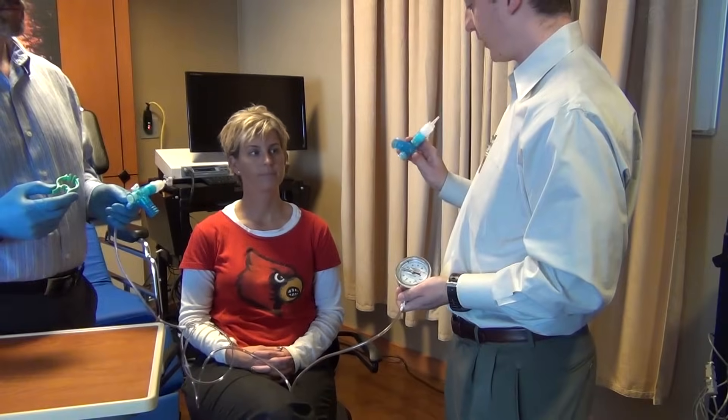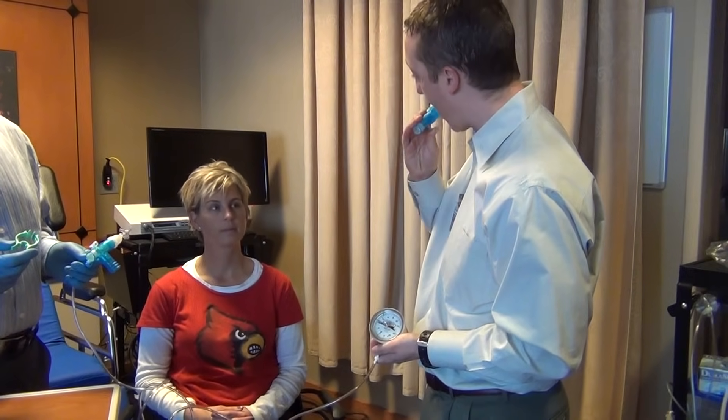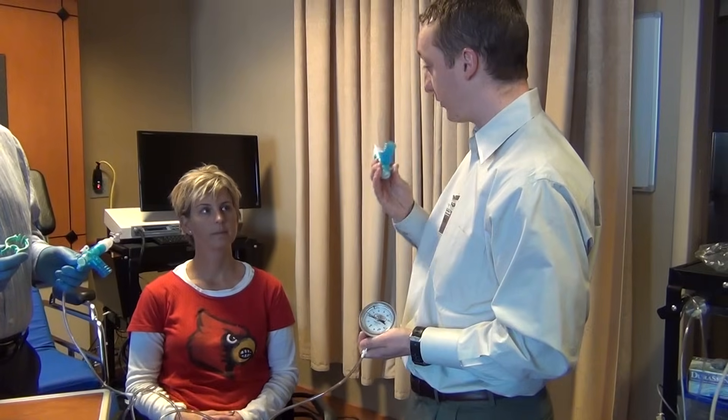This is the mouthpiece that you're going to use. You have the three ridges. You put your teeth on the ridges and bite down on it tightly, and then wrap your lips around it so there's a tight seal.